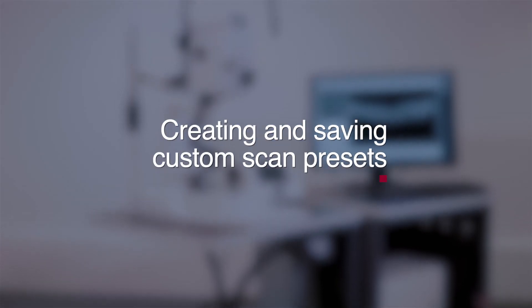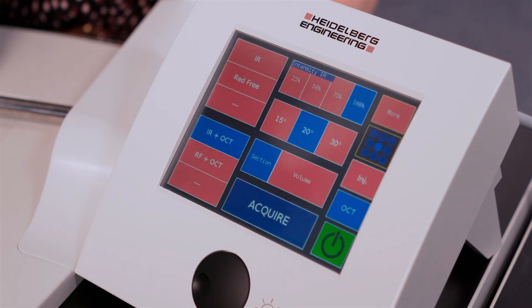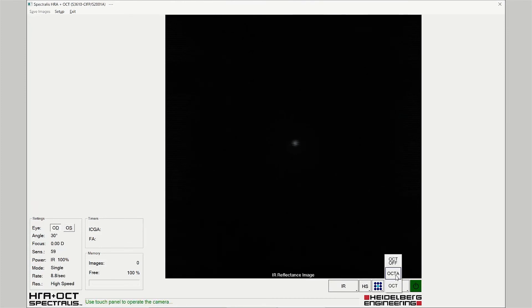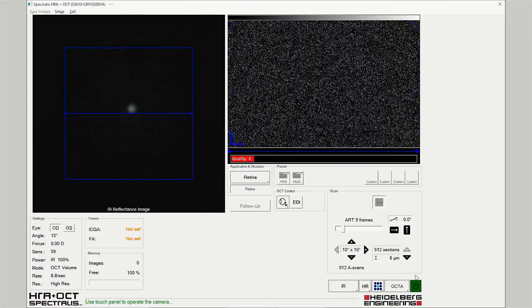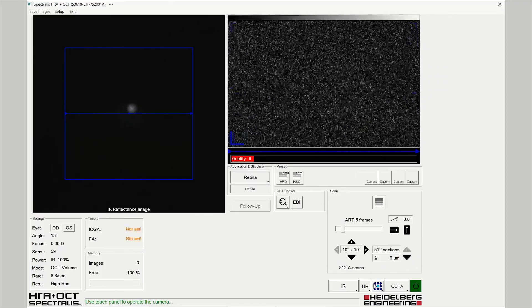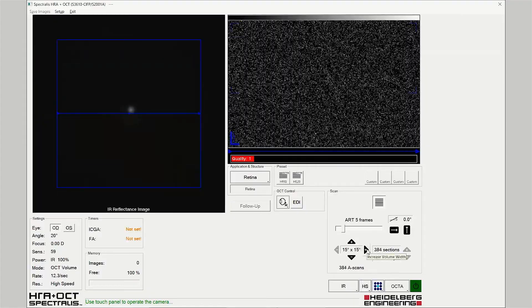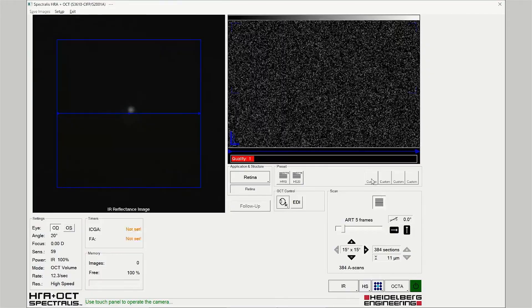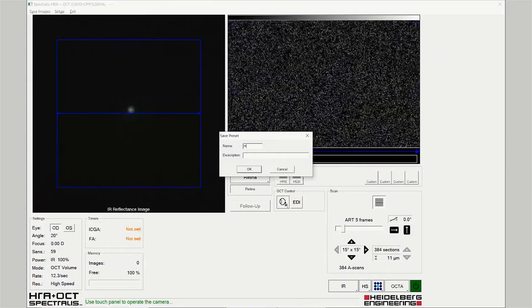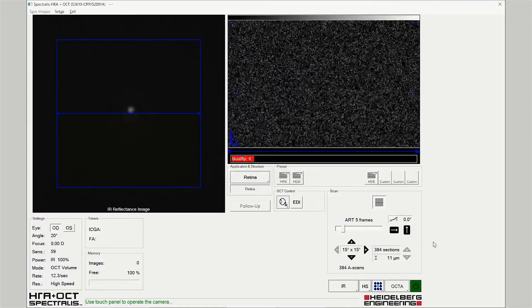Creating and saving custom scan patterns. Open the Spectralis acquisition module and select the OCTA imaging modality. The default scan pattern is a high resolution 10 degree field of view. Select the high speed option and increase the scan field to 15 by 15 degrees. Click and hold the custom scan button and name the scan 'High Speed 15'. Click OK to save the scan pattern.